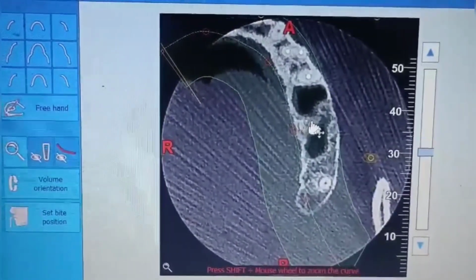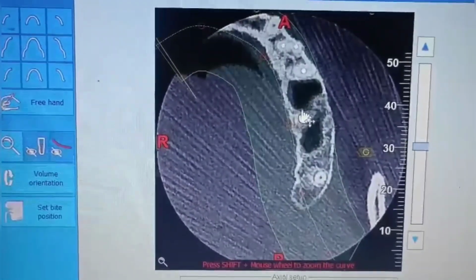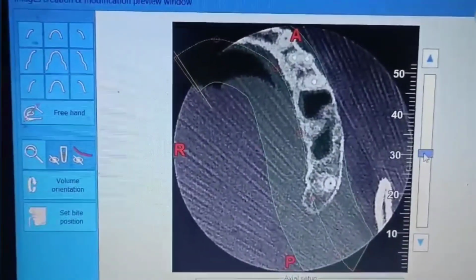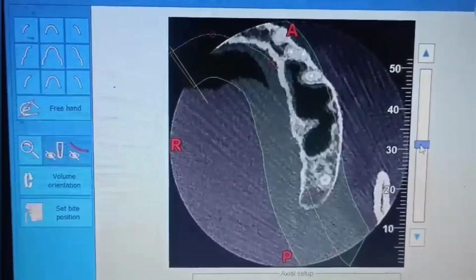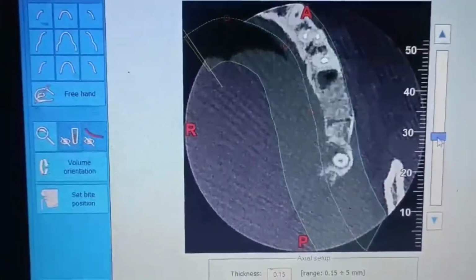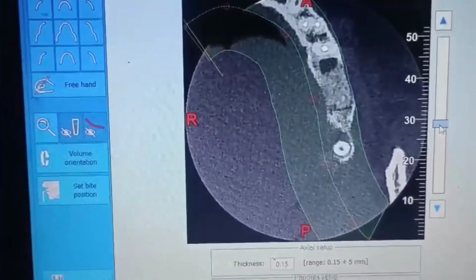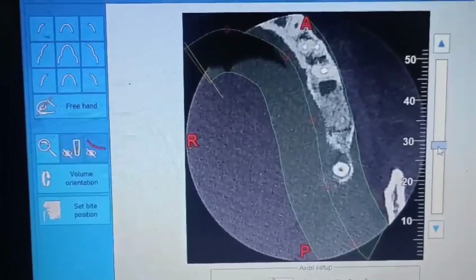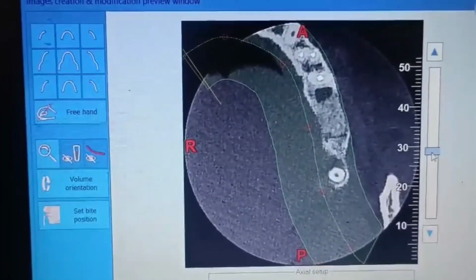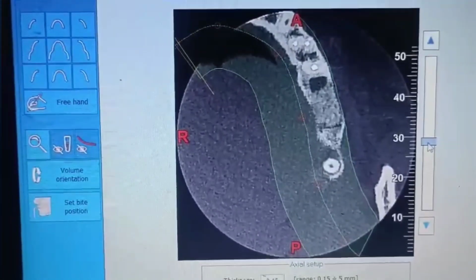So a good diameter implant can be placed here with expansion to the mesial and the distal area, utilizing the complete possibility of the length which is up till here, up till this region. So the possibility of 6.5 by 4.25 is planned here, but with a little bit of sinus lift you can go up to 8 mm. This was the plan, and let's see how that was executed.